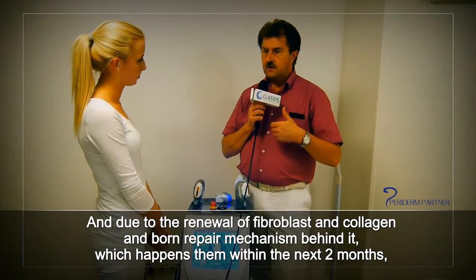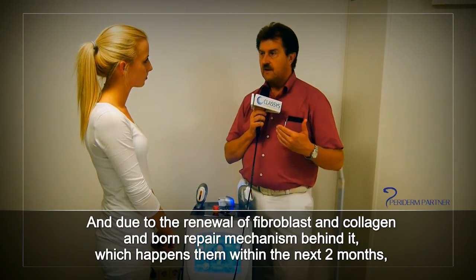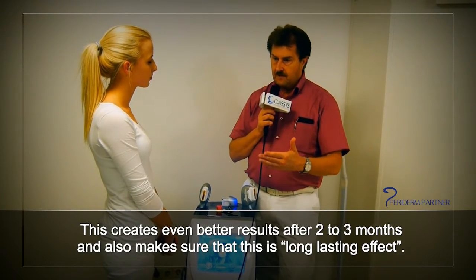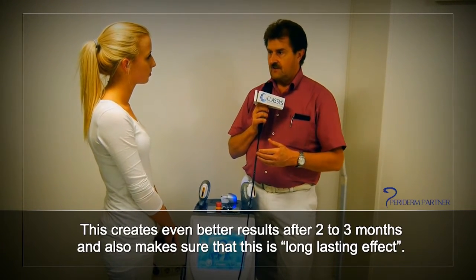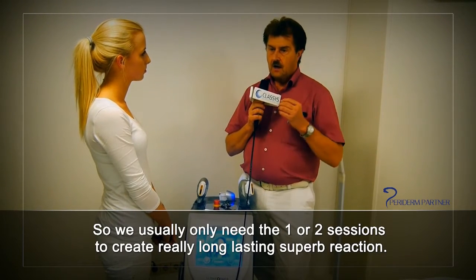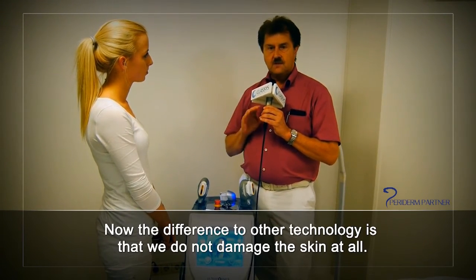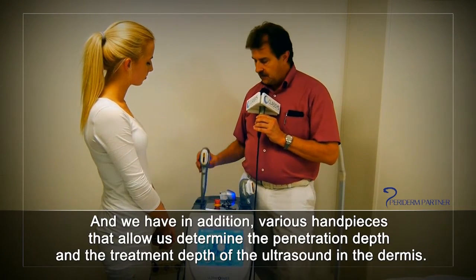Due to the renewal of the fibroblasts, the collagen, and the wound repair mechanism, which happens within the next two months, this creates an even better result after two to three months and ensures a long-lasting effect. Usually we only need one, maybe two sessions to create a really long-lasting, superb reaction. The difference to other technologies is we do not damage the skin at all.